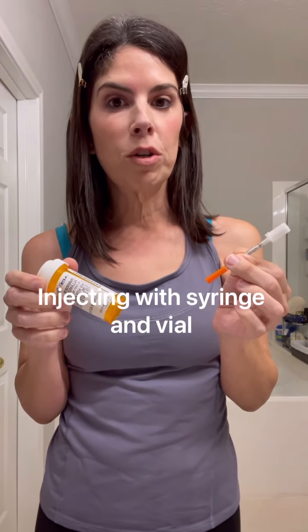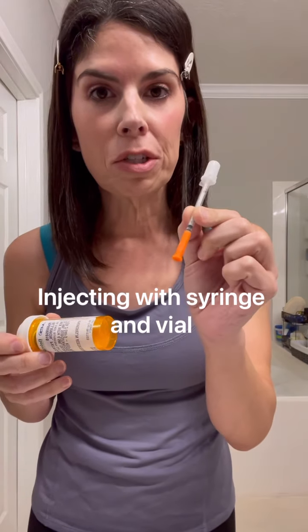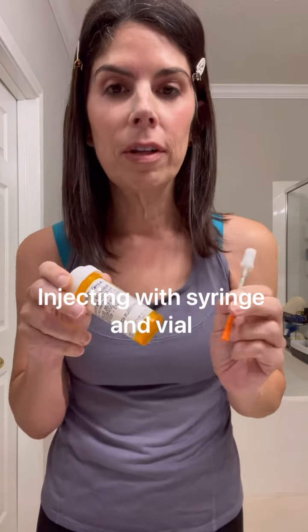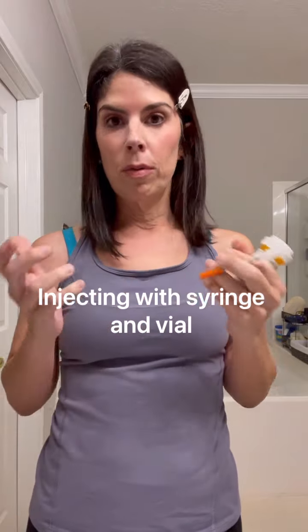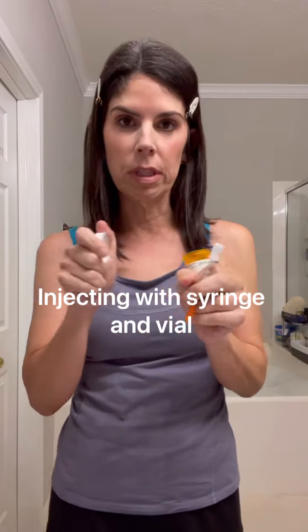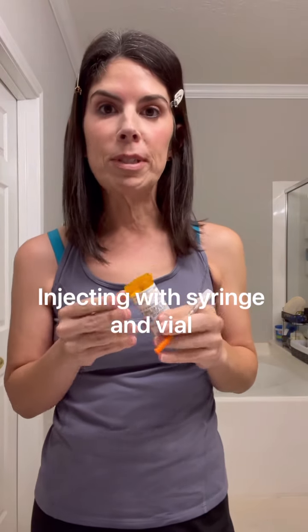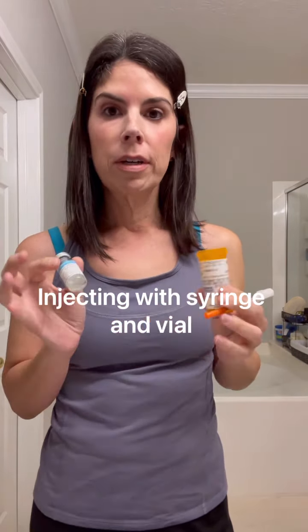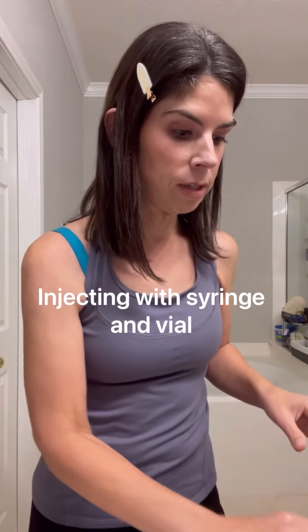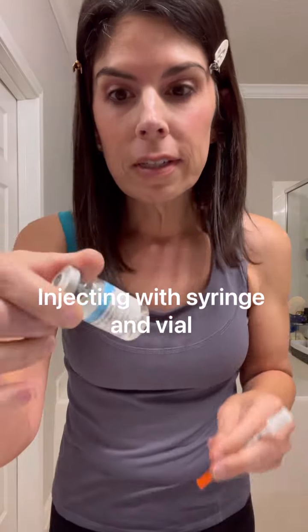This video is for those doing an injection with a needle, syringe, and vial — for example, if you have compounded semaglutide or are taking peptides. This is different from using a pen or auto-injector. First, inspect your medicine to make sure it looks clear and is the right medicine.